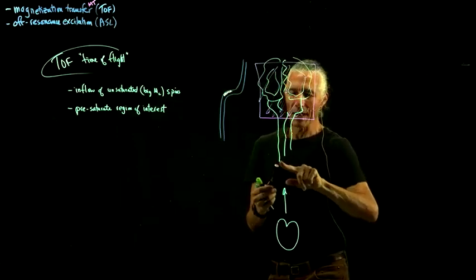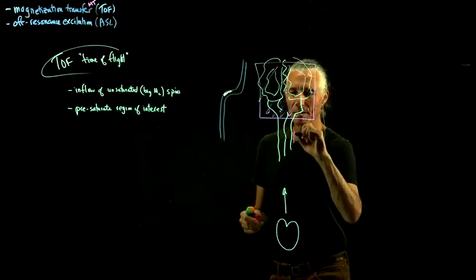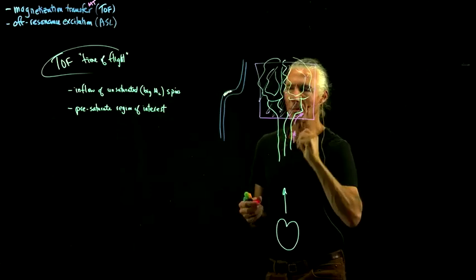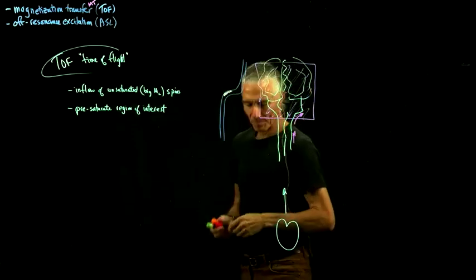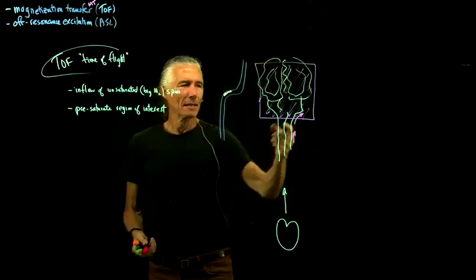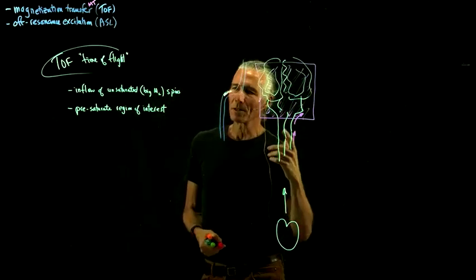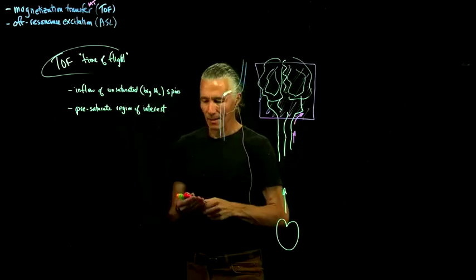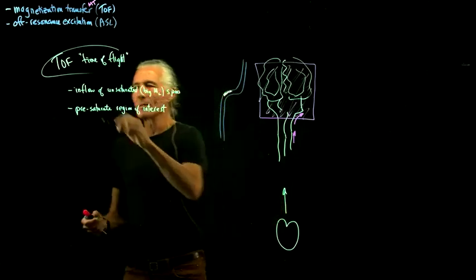Then wait a little while for some unsaturated spins to flow in. So wait until they flow in just a little bit. You don't have to wait very long, and then do an image. And so what you should get is just blood vessels, and that's pretty much what you can see. So how do you do it?